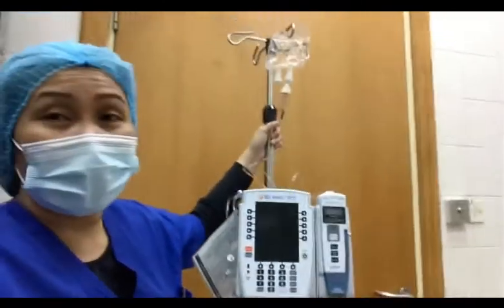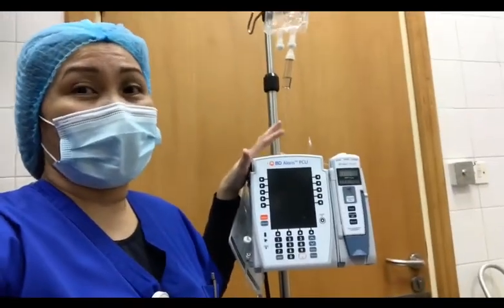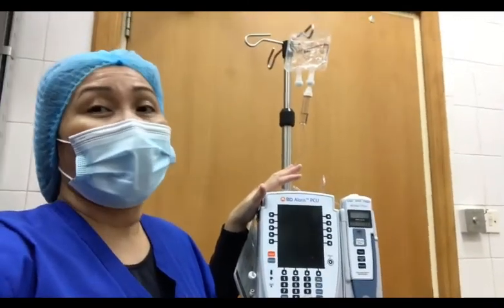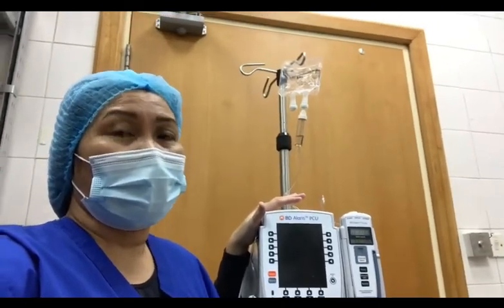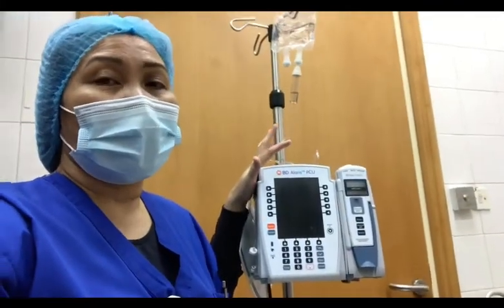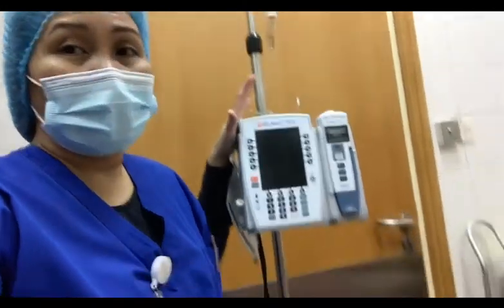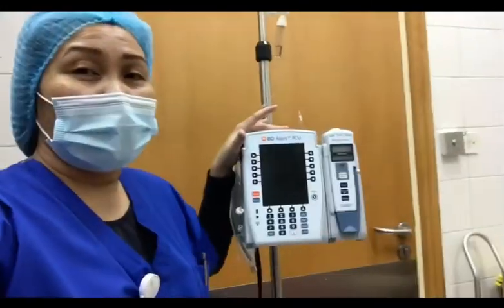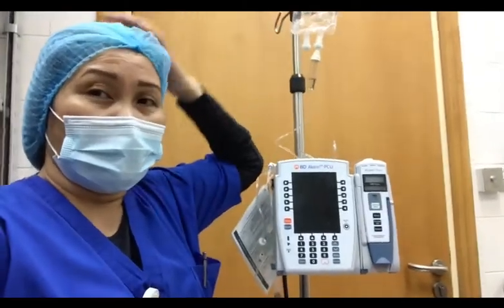Today's vlog, I'm gonna show to you how to manipulate this ALARIS infusion pump. It helps a lot sa ating mga nurses kasi napapadali yung ating trabaho. We don't have to check if we have finished the infusion. So, by the use of this machine, it will just alarm automatically once the infusion has finished. How to use this machine is what I'm gonna show to you guys.